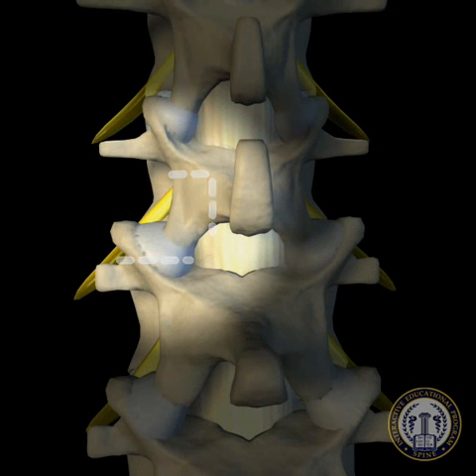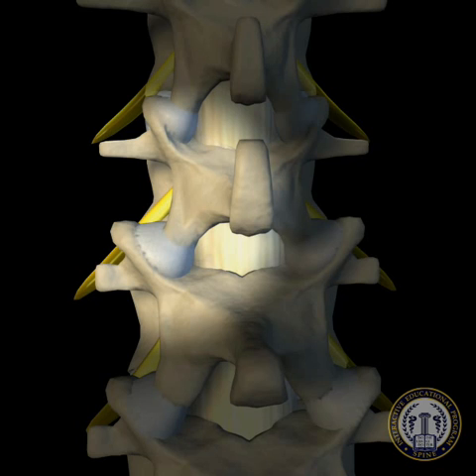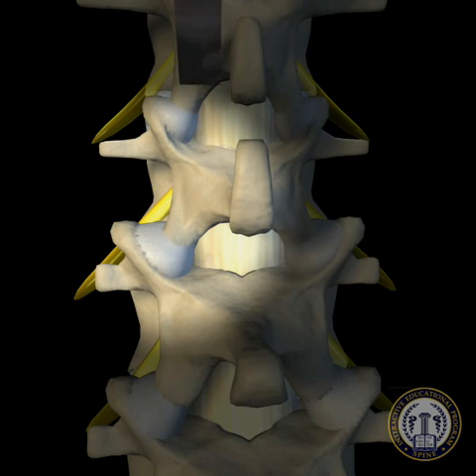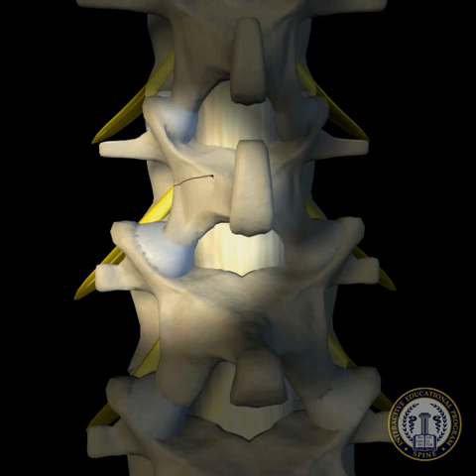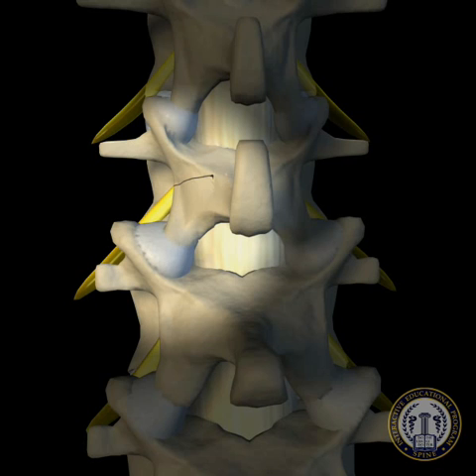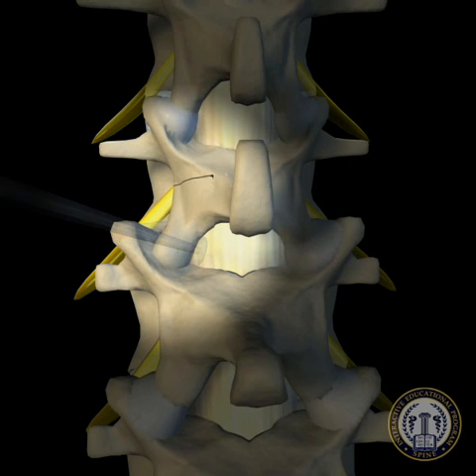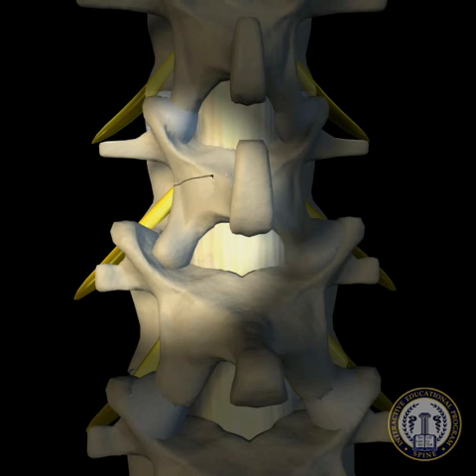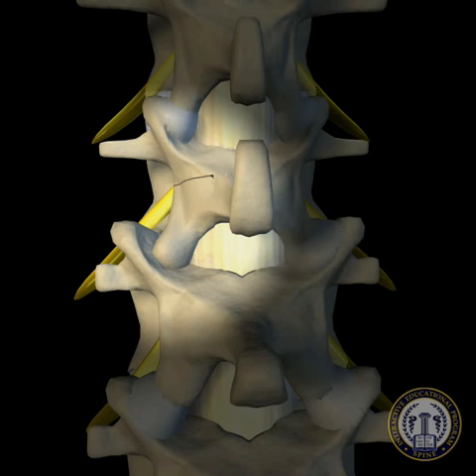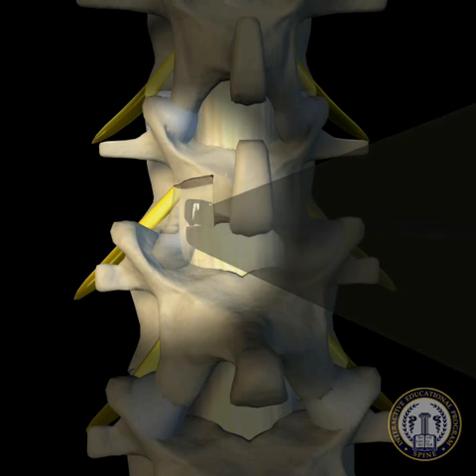A total facetectomy is now performed using either a high-speed drill or bayoneted osteotomes. The initial cut is made across the medial aspect of the inferior facet, disarticulating it from the superior lamina. The synovial membrane is then separated from the ligamentum flavum using curved curettes. Care must be taken as these tissues are in continuity with each other and form a single plane in the lateral recess. The inferior facet may then be removed using a pituitary rongeur.